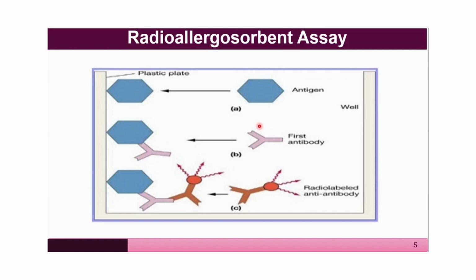Since the test is named radioallergosorbent assay, the allergen, that is the antigen, is adsorbed onto the surface of the inert material, and then it is used for the detection of the allergic antibody produced in a patient.